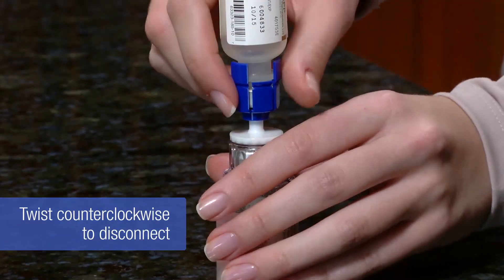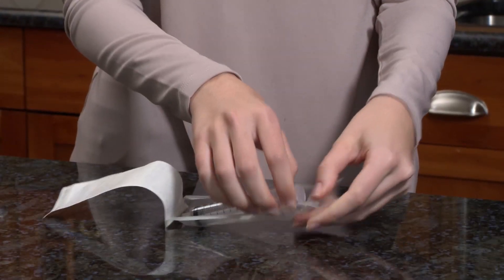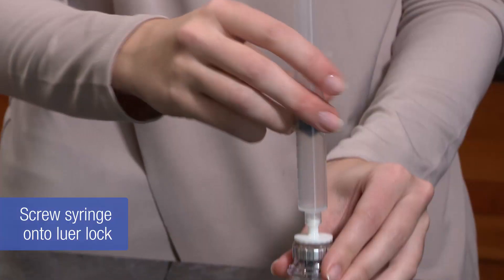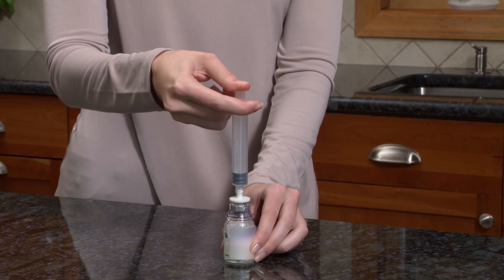Disconnect the blue end of the mix-to-vial with the water vial attached by twisting counterclockwise. Draw air into an empty sterile syringe. Screw the syringe onto the luer lock of the mix-to-vial by twisting clockwise. Push down on the plunger to inject the air into the product vial.